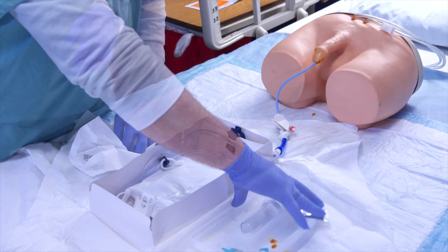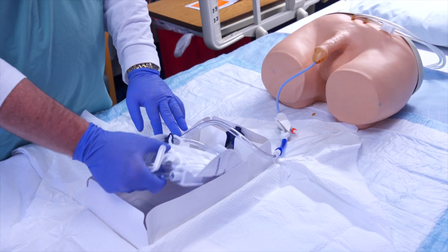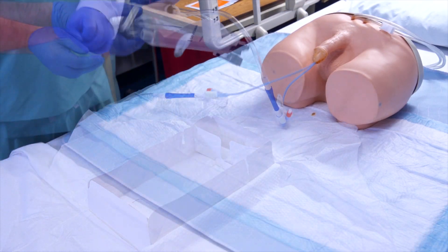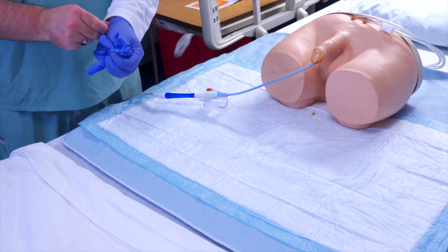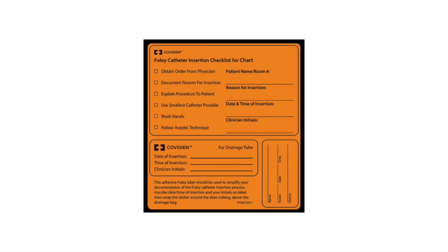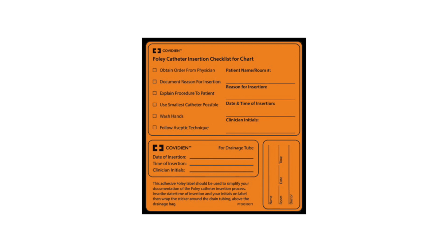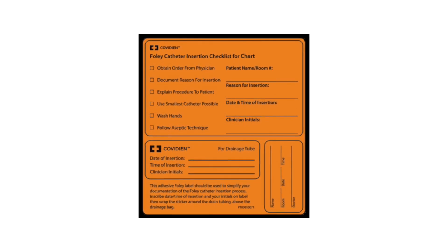Dispose of supplies and the sterile field from the patient's bed. Remove sterile gloves and perform hand hygiene. Document the indication for insertion, date, time, size of catheter, and unit.